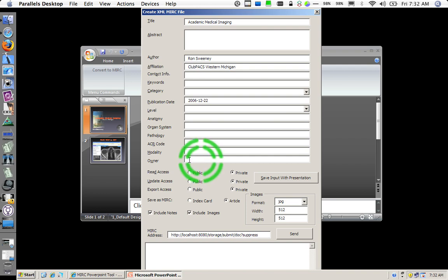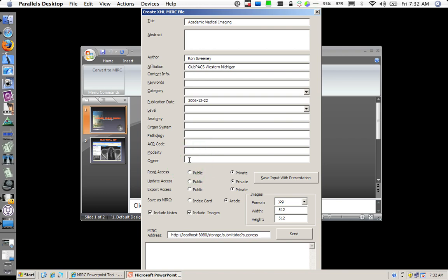This particular field, the owner field, is who you are, who you are going to log into on the MIRC site for that particular storage service. It is important to do this so that you own the document once it is sent in. So I set this to my username on the MIRC site.